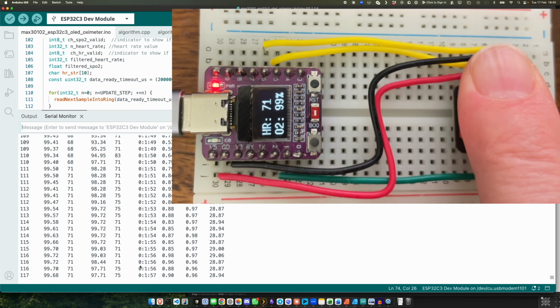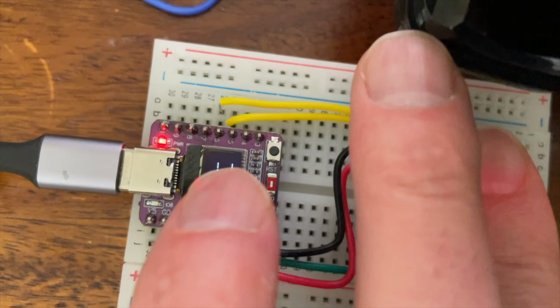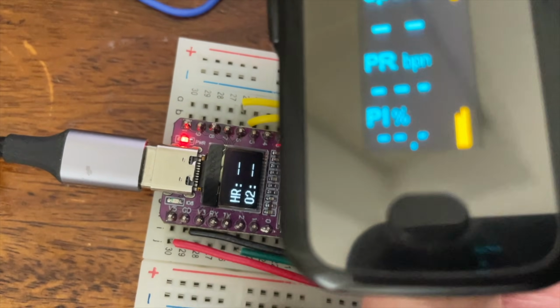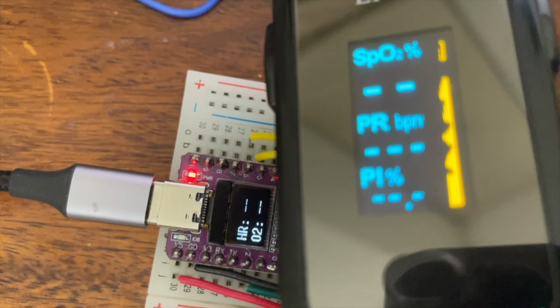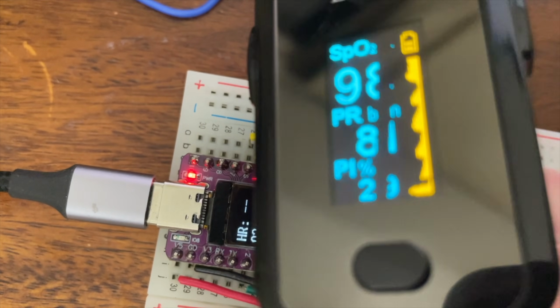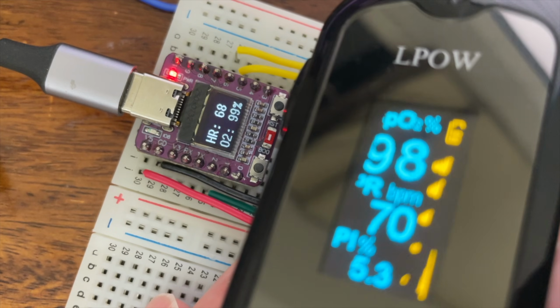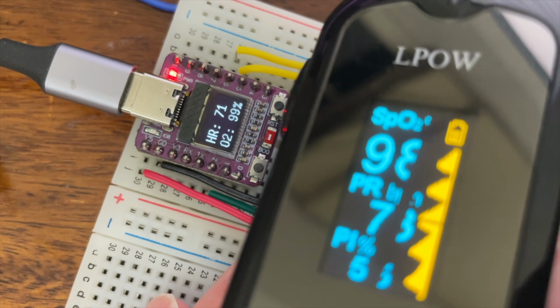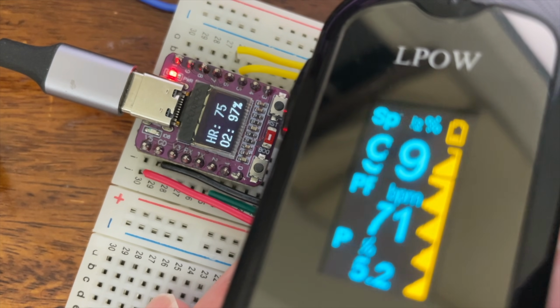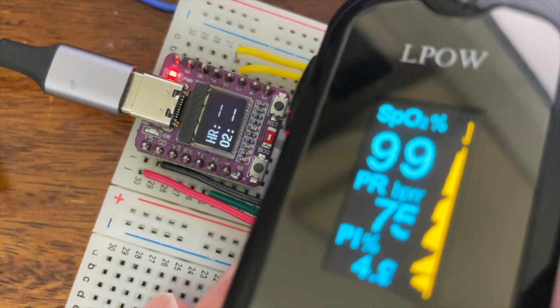Now let's bring in a commercial one. Plug this in. If I can hold everything still and keep everything in shot. So of course I've moved my finger, and now hopefully we'll see if the measurements actually match up. Alright, so it's not too bad, it matches up pretty well. So we're getting a heart rate of around 70 on the C3, matches up to what's on this little monitor on my finger, and we've got 99%, I just lost it.